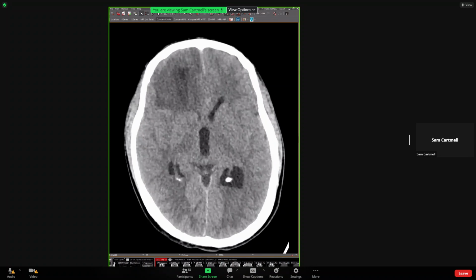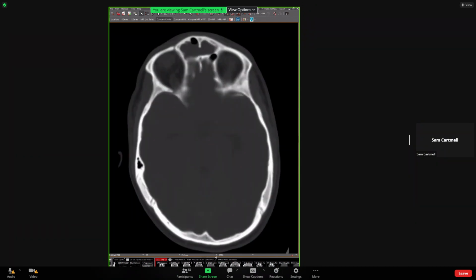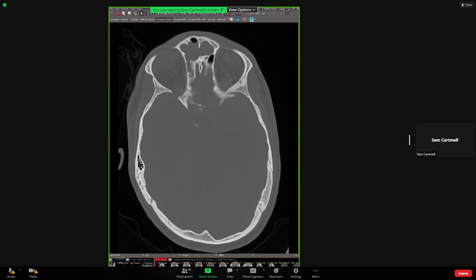But here's the non-contrast CT of the same patient, actually taken a day before the images I just showed you. There's clearly asymmetry of this right frontal lobe. There's hypodensity, and given that it's adjacent to this sinus disease, you might start to scrutinize it to see if you can see any focal dehiscence. But even if you can't, there are interosseous channels through the bone here where you can get spread of sinus disease into the intracranial compartment.